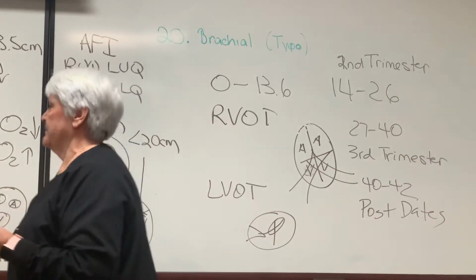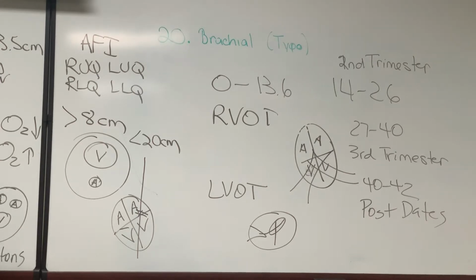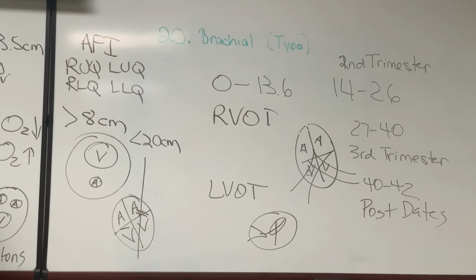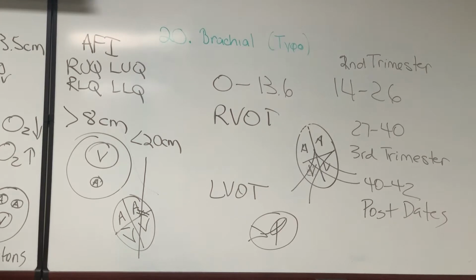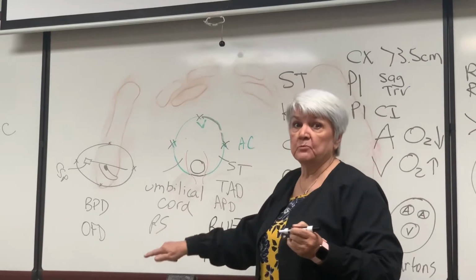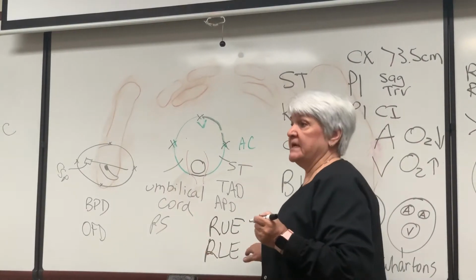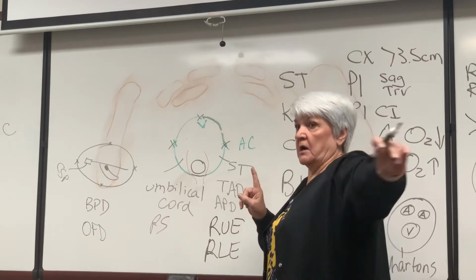Okay, so I'm going to do the right upper extremities because my right side is closest to the transducer. Then I'm going to go ahead and do my right lower extremities. I'm going to use my dual function for my imaging. I'm going to put my femur on one side and my tib-fib on the other side. I'm going to put my humerus on one side and my radius and ulna on the other side. So I have one image for a whole extremity.